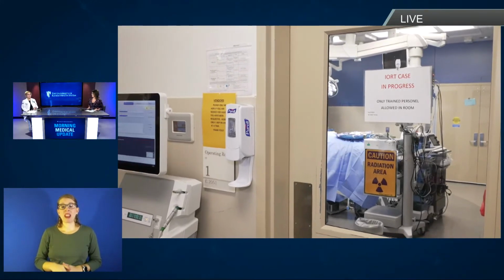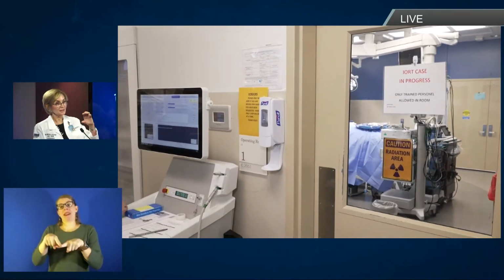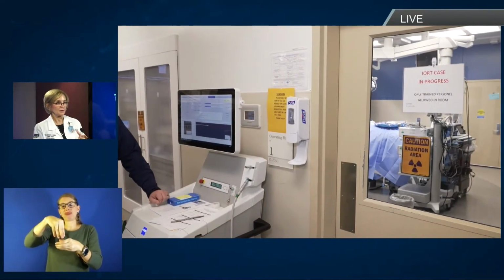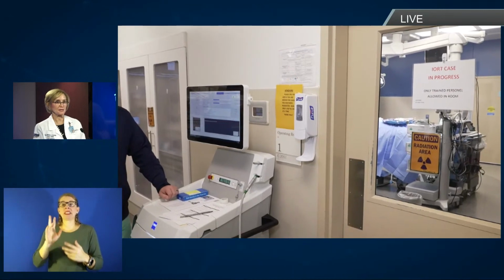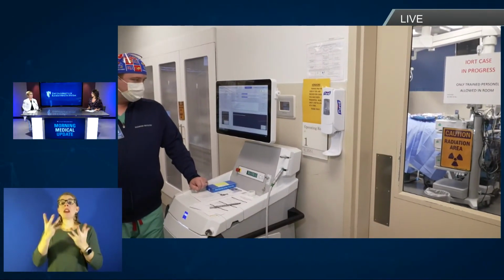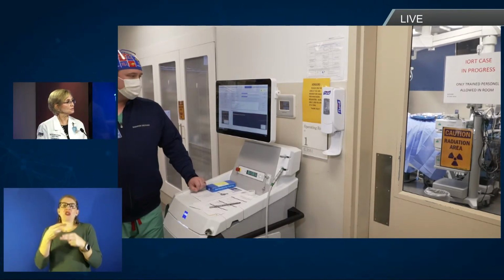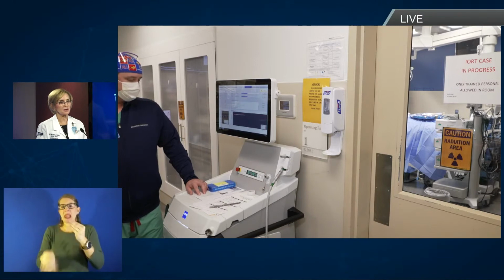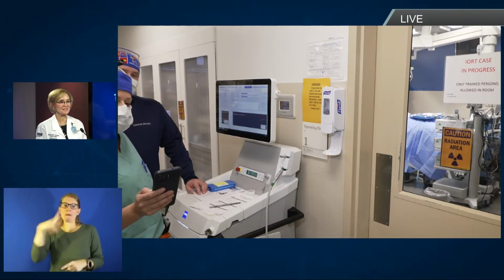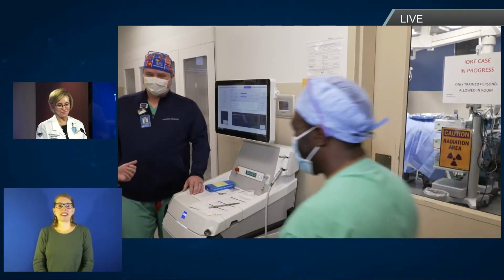And the actual radiation piece of it is going to depend on the size of the sphere that fits the lumpectomy cavities. So it could be anywhere from about 17 minutes to 30 minutes. They'll know once we get in there, so we size the lumpectomy cavity. But I tell patients we're going to add about maybe up to another 30 minutes to your operating time, but you'll be taking a nice nap. And you'll be able to go home as soon as it's done. Wake up from a nice nap and ready to go home. Yeah, and they'll feel great.